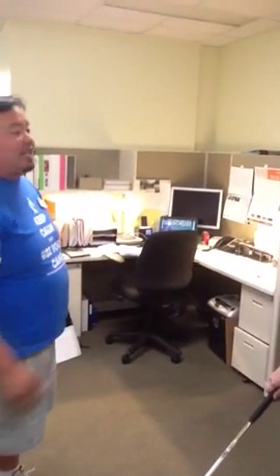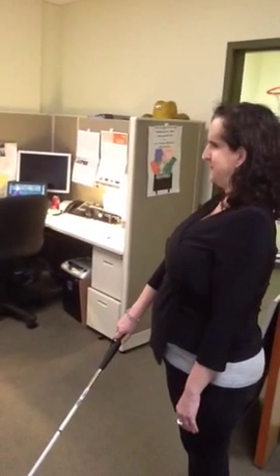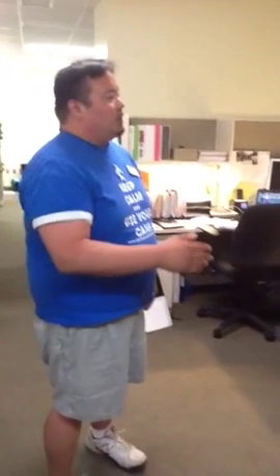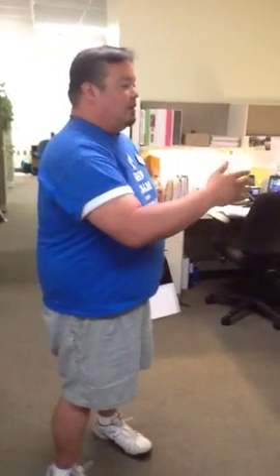Yeah. So as you're moving down the hallway, other people will be coming on the other side. You should know people will be walking to the left. If you're toward the right, you're usually going to be close to the wall. As you're traveling down the hallway or along the wall, make a note of things that you pass: the door, how do you get there, fire extinguisher, plants, chairs, so that you can recall it again. Because part of it is we're going to go from point A to point B, then back to A. And I need you to be aware, so it's not a surprise on both ways that you've hit something or that you've crossed something. Okay?